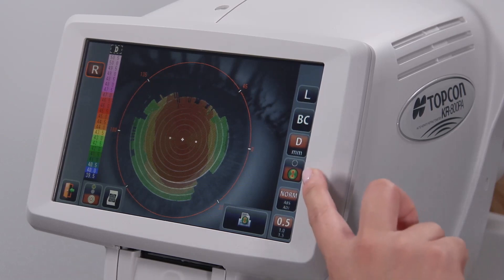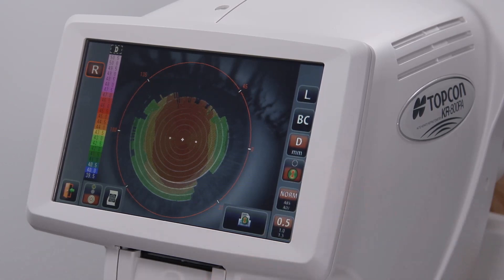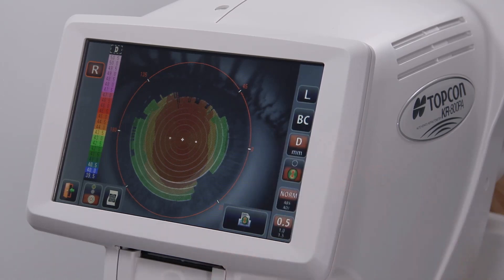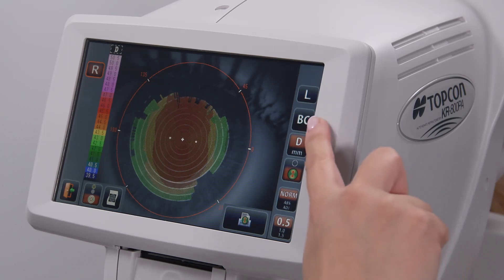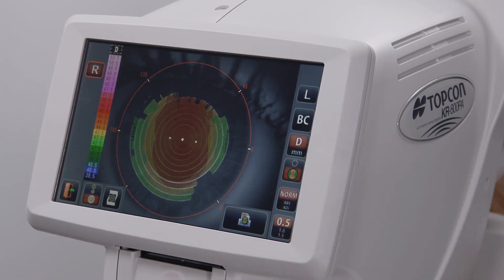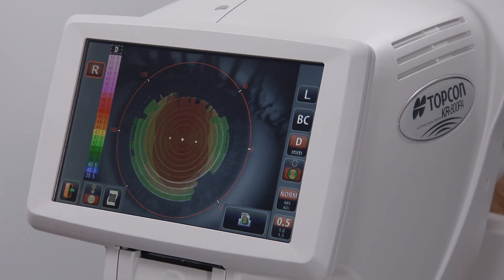The corneal map icon is used to determine whether the corneal map will be included in the printout. The units icon can be used to change the corneal measurements from millimeters of radius to diopters of power. This icon displays the average curvature values of four of the meridians, and the exit icon takes you back to the previous screen.